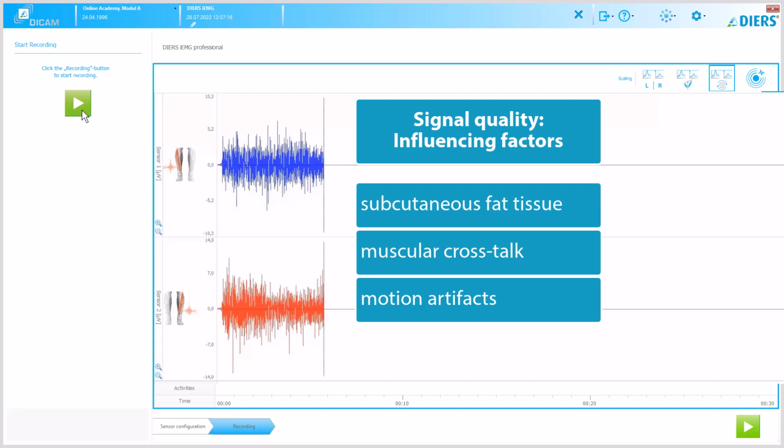There are also several forms of noise. Among them is ambient noise, which can be caused by interference voltages. But physiological noise can also influence the signal quality. This can be an ECG signal, for example, or it can be triggered by the surrounding respiratory muscles. Furthermore, there can be background noise that emanates from the electrodes.